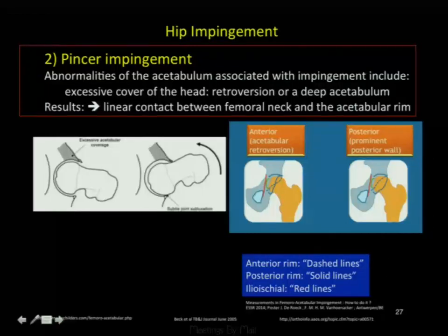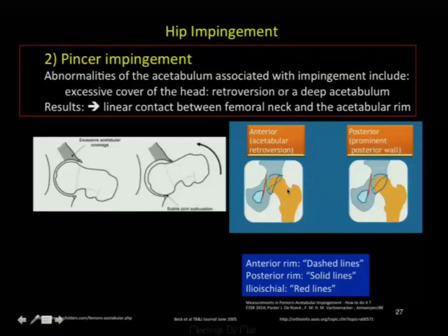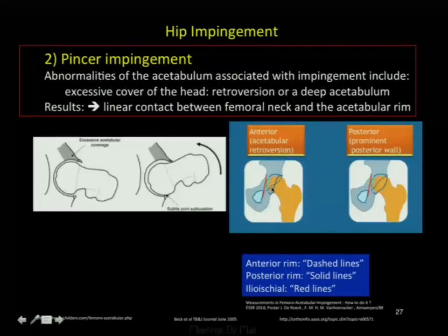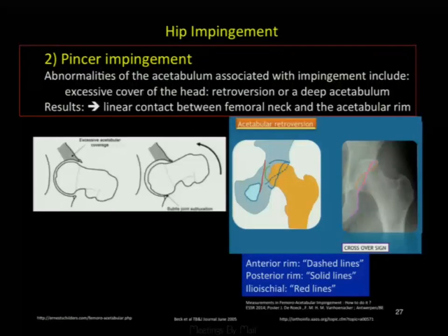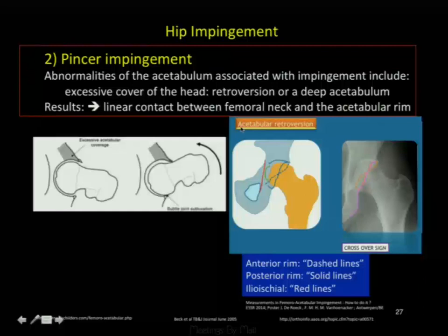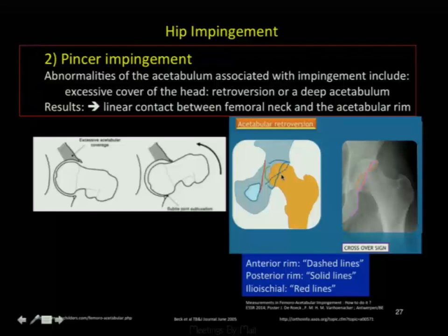The dashed lines represent the anterior rim of the acetabulum and the solid line represents the posterior rim, showing how it abnormally covers. This is anterior acetabular retroversion, and the red line represents the ilioischial line as a reference. In the blown-up example of retroversion, you can see the overcoverage illustrated with the dotted line.